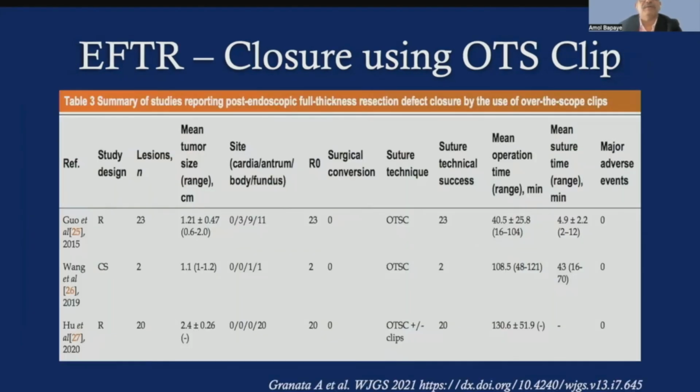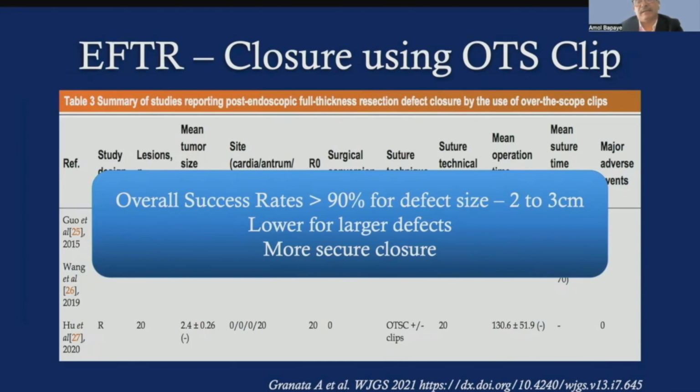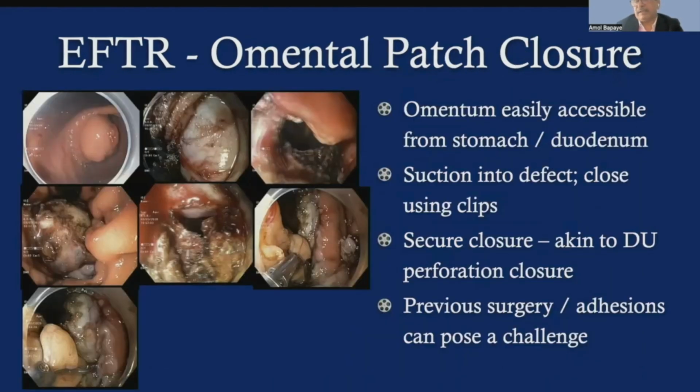That is very effective. And for the correct defect size, the closure is very effective using these techniques. Another option is to use an omental patch to close these defects, very similar to what surgeons use in surgical techniques.